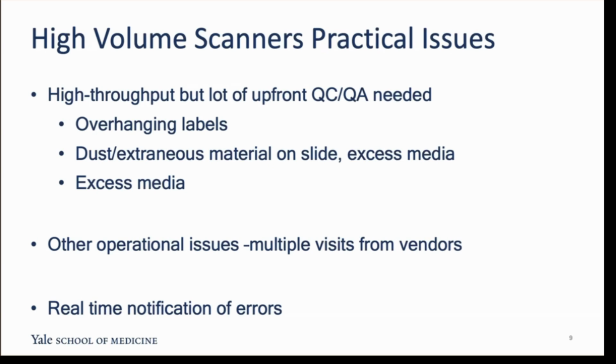But there's one particular error that is called slide handling error, which if that happens, the scanner comes to a stop. And the reasoning from the vendor is that the physical slide is at risk of being destroyed. And since that's an irreplaceable asset, if there is slide handling error, the machine comes to a stop.